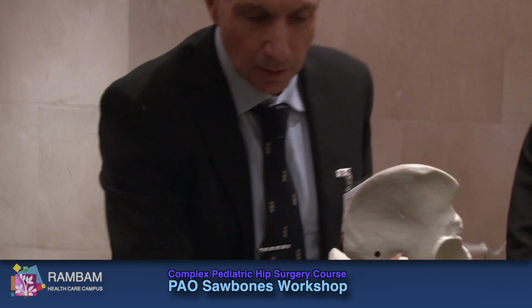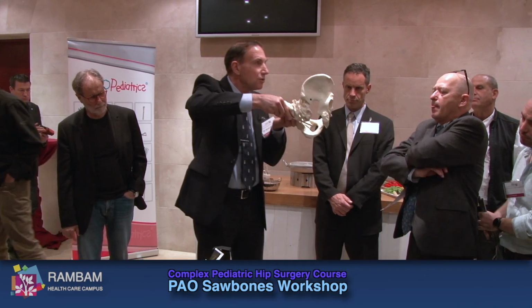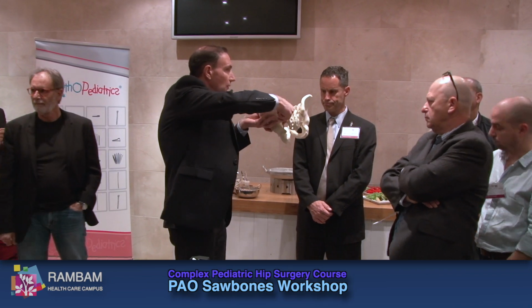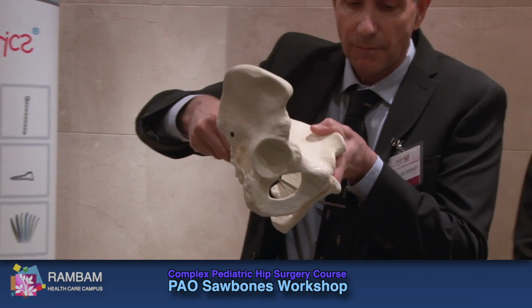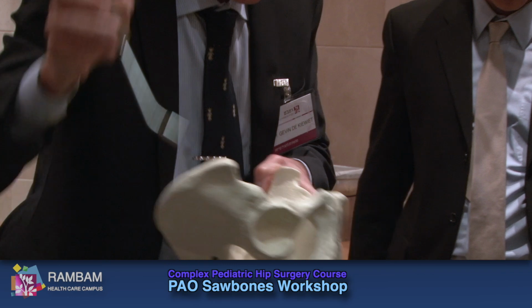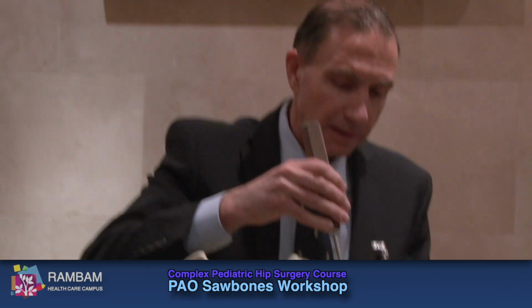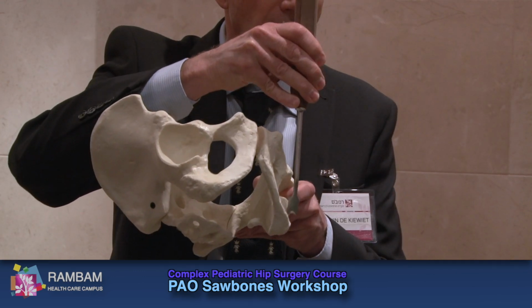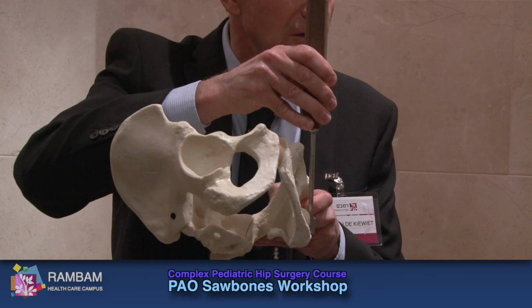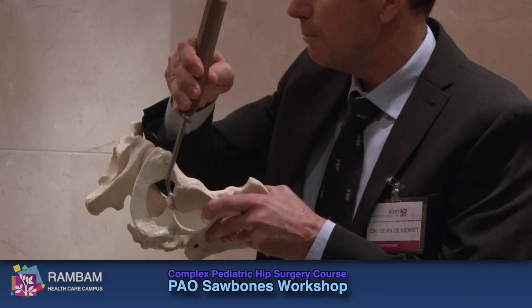And your osteotomy, you want to be coming up towards the spine like that. You see that? That's the direction of the osteotomy. This osteotome, you start off, what you do is, see it's notched. The idea behind that is I can sit that notch on the obturator, on that insert. I can go into the obturator foramen, go down this way, and feel this. So with my fingers, I'll get the mental picture of how big this piece of bone is.